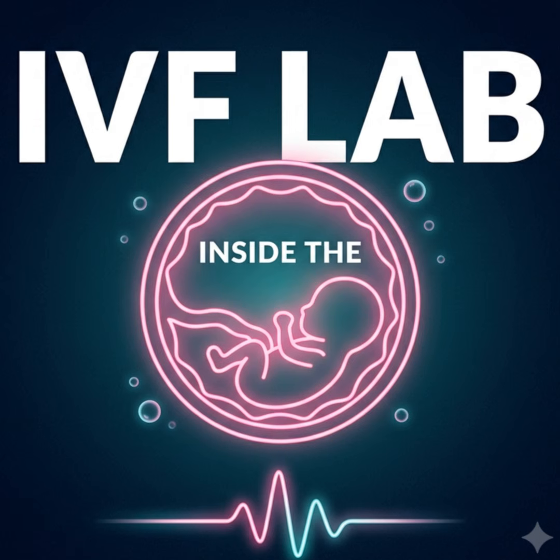And as the embryo grows past the 8-cell stage, those individual cells start acting collectively, right? The milestones change. They do. Around day 3 or 4, we watch for the timing of compaction. This is a breathtaking event to watch on time-lapse. The individual, distinct cells begin to blur their boundaries. They express protein molecules called E-cadherins, which act like biological Velcro, zipping the outer membranes of the cells tightly together until the embryo forms a solid, smooth sphere called a morula. We track the exact hour that compaction begins and how long it takes to complete.